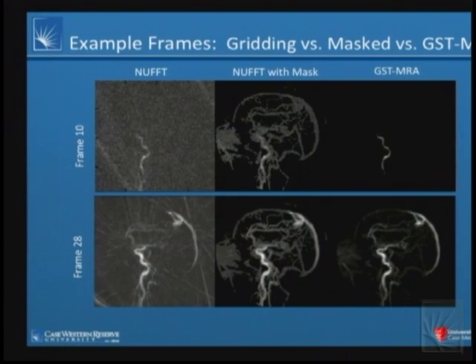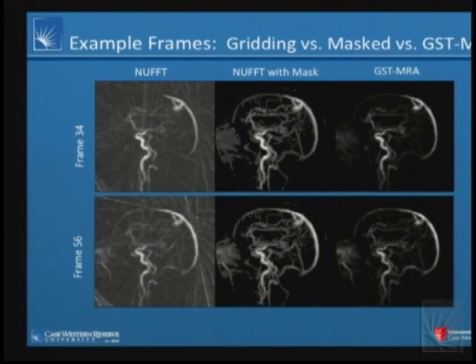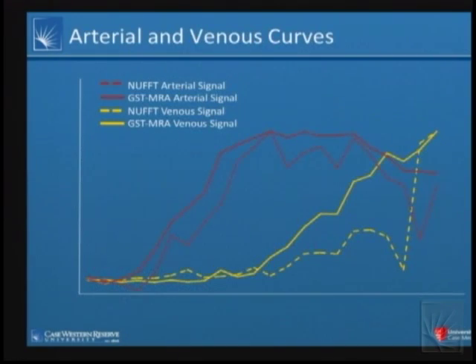So this is the contrast agent just coming in, spreading out, filling in the vessels, moving on. And this is at a level where it's just on the edge of being diagnostic. This is something that could be translated in a very short amount of time to the clinic. And each one of these now is a whole volume being acquired in about 200 milliseconds. So this is really fast data.